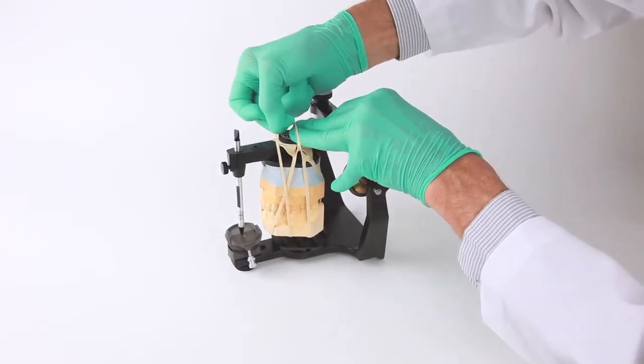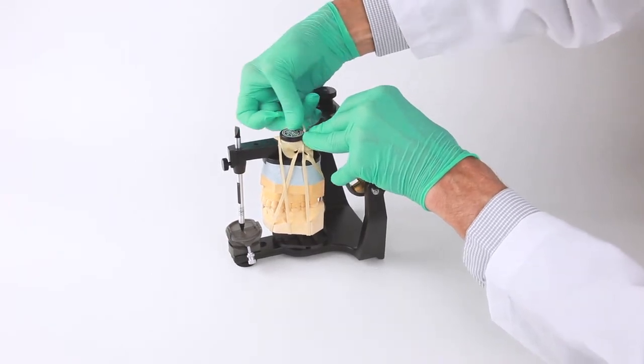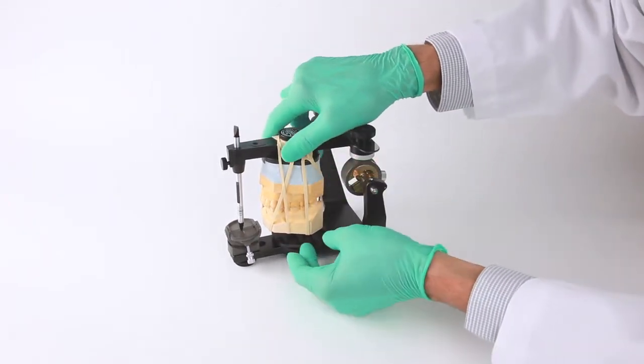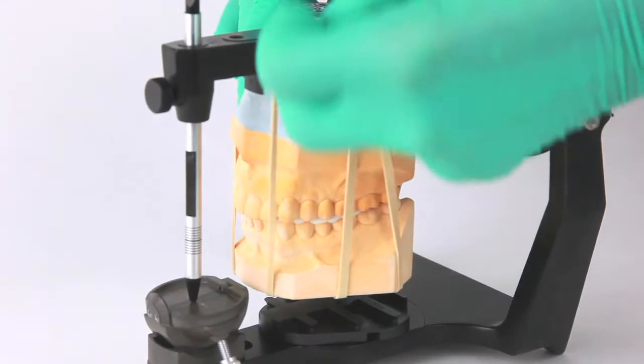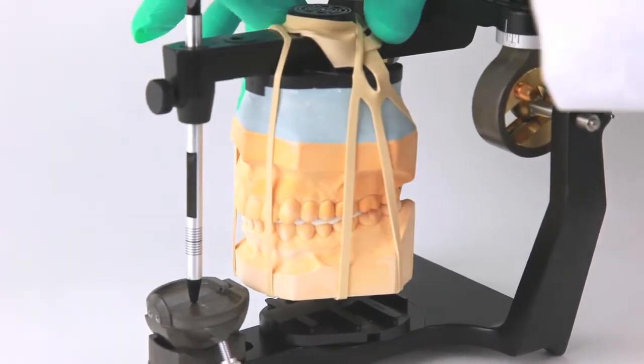If increased tension or stability is desired, any one or all of the elastic arms can be stretched and looped over the thumb screw on the articulator arm.